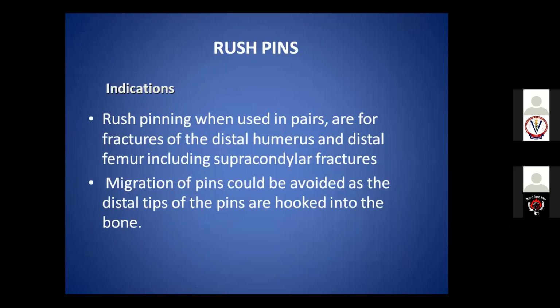Another modification of these pins is what we call rush pins. Rush pins are nothing but simple intramedullary pins with a slight modification at one end of the pin.